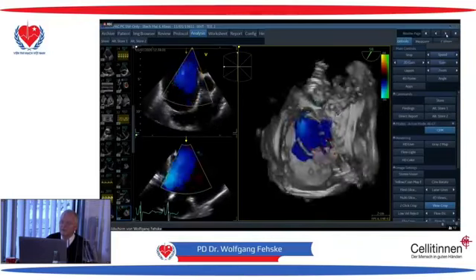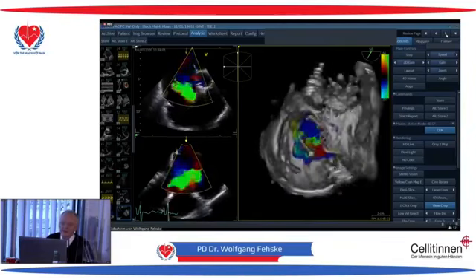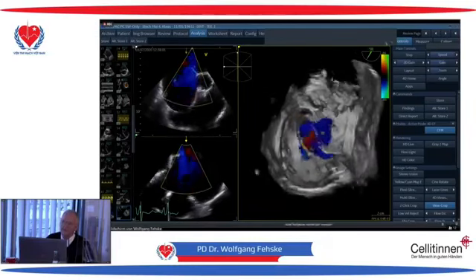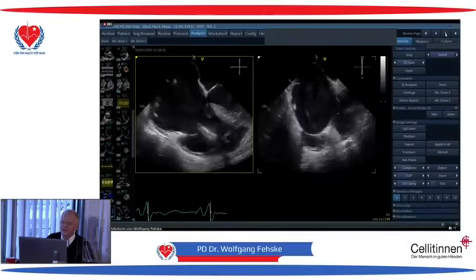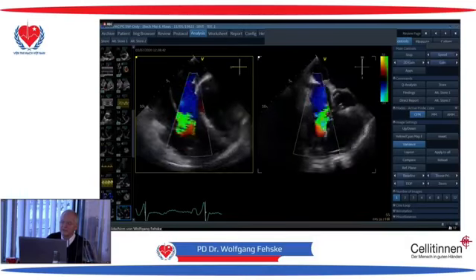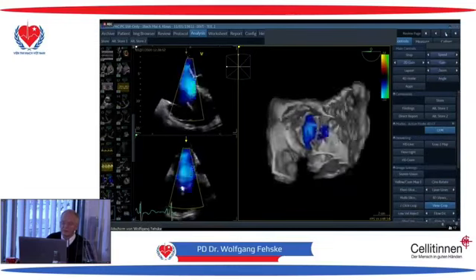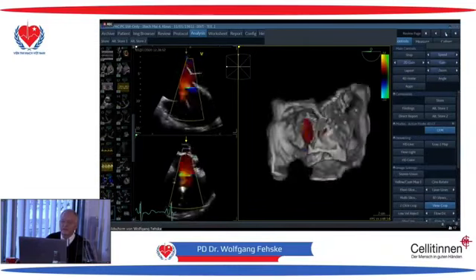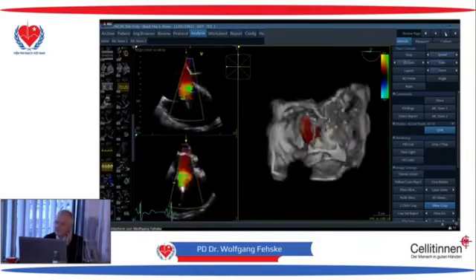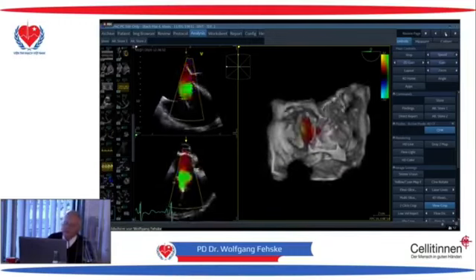So Dr. de Kock showed you minutes ago how we try to find the tricuspid regurgitation. You see, it is very difficult to find a good place in this large heart, but finally we tried to find it here. You see it again, and we do it in the same way as we did before. But there is one thing which is absolutely clear, that normally the tricuspid valve can be much better displayed from the transthoracic view than from the transesophageal view.